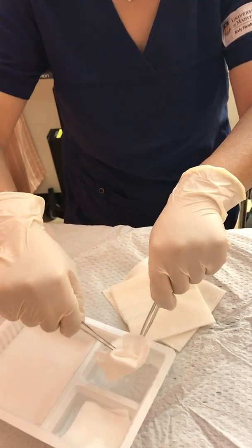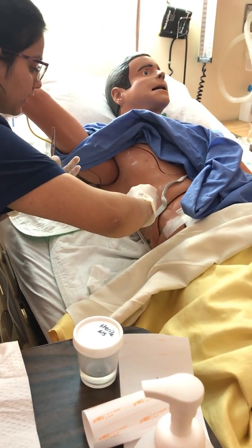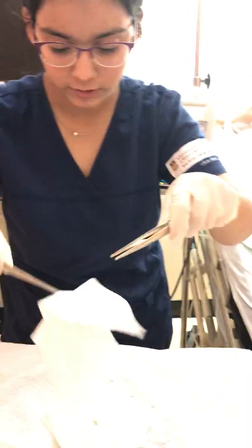Dip it in, get rid of the water. So get my date and time. Now we're just gonna clean the surrounding area. There. So now that we have cleaned the whole area, we're going to dry it.